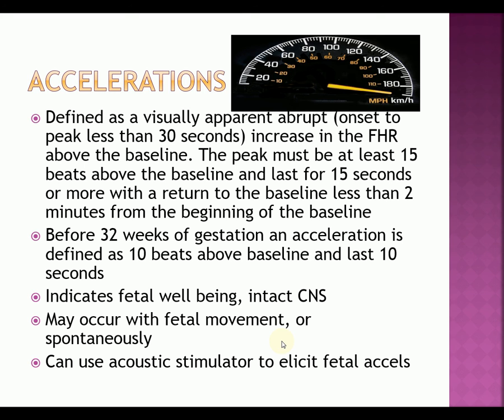An acoustic stimulator is that device you'll see people using with a trach to be able to talk, and you can just buzz them with that. Usually you'll see them spread all four legs out, or all four extremities. I don't guess they have four legs. Let's hope not, unless you're doing your baby's dog.